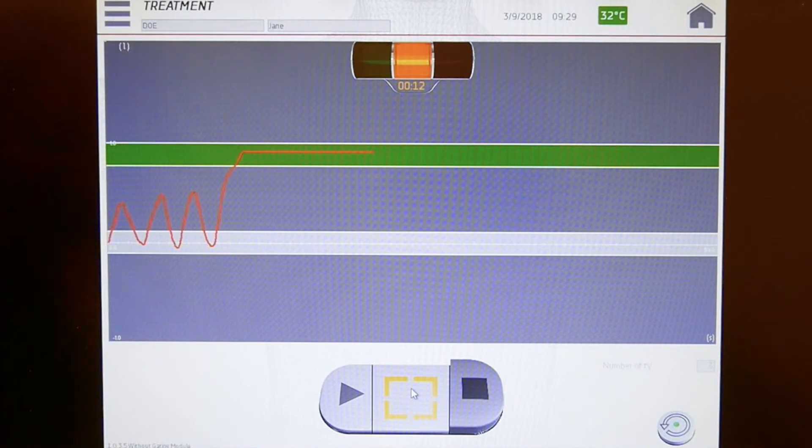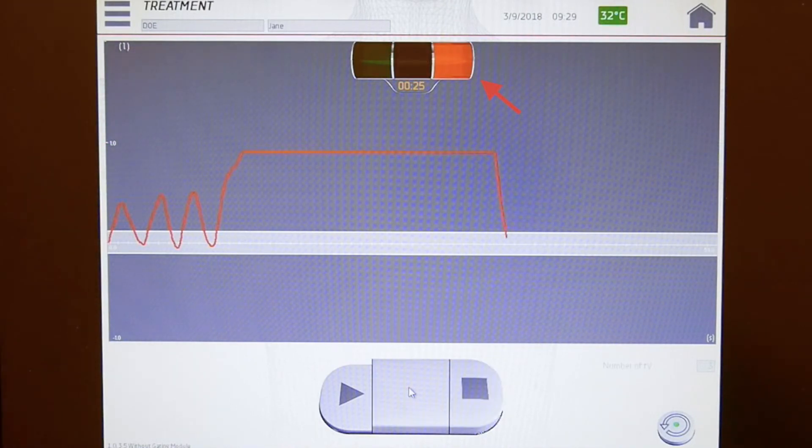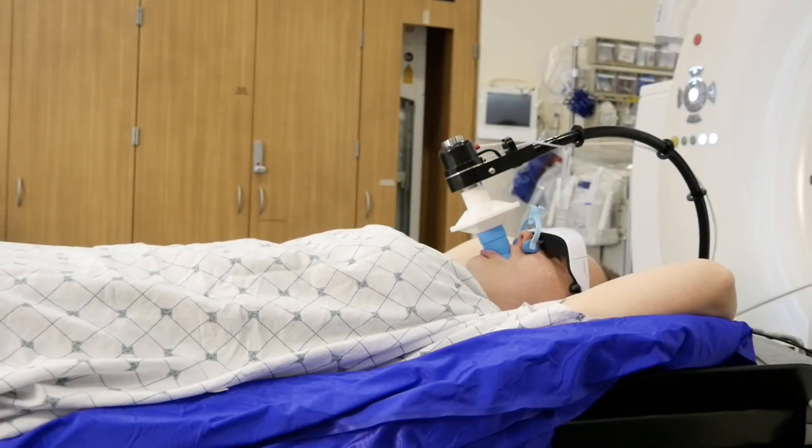You will see a timer showing how long you hold your breath. During the simulation, we will determine approximately how long you can hold your breath. When the red light turns on, that indicates to you to start breathing normally until the therapists are ready for the next breath hold. If at any time you are unable to comfortably hold your breath, resume normal breathing and the therapist will turn off the radiation beam and allow you to breathe normally. They will continue your treatment when you are ready.